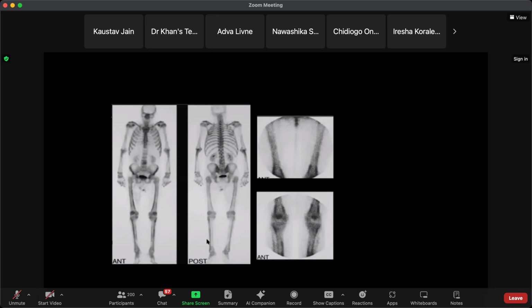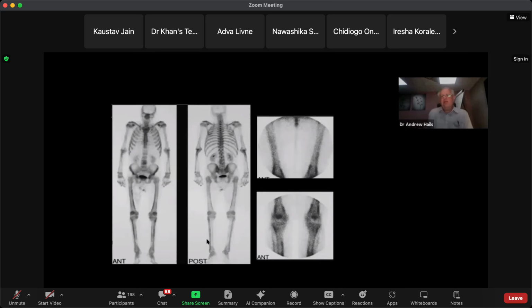I would obviously in clinical practice correlate with any plain film to see if there was any aggressive periosteal reaction, but given the symmetry and the context of edema, could this be venous insufficiency or edema? That's not a bad idea. You can get something similar with venous insufficiency. Probably it actually goes up a bit here into the femur. So anything else other than venous or arterial insufficiency that might produce this?